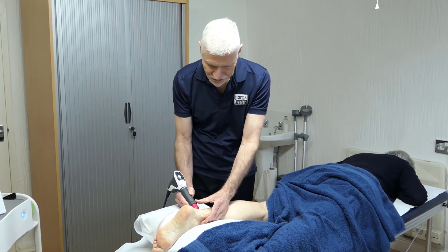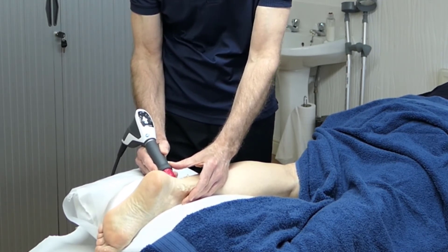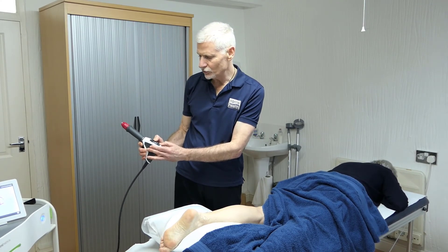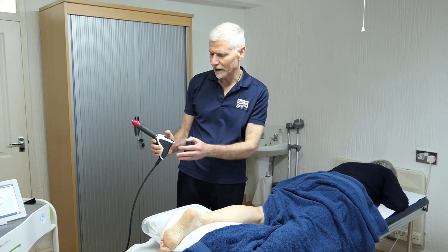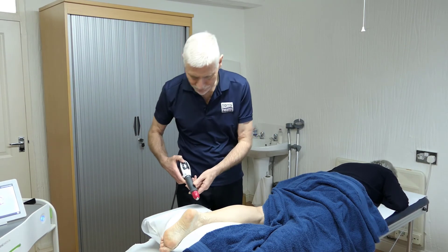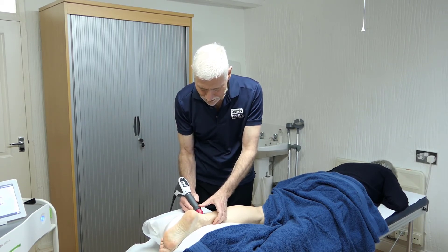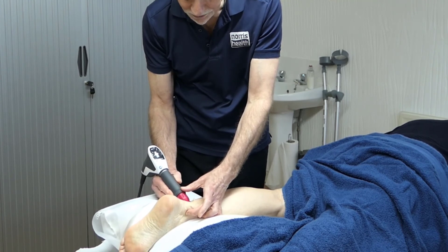At the moment I'm treating the side of the Achilles — the lateral aspects — and I can also treat the back and the medial aspects. Once I've done that, I can then increase the pressure and reduce the frequency, giving a different amount of force going in. My pressure now is one and a half bar and my frequency is eight hertz, producing a different sound on the machine. If I put my finger on the other side of the Achilles, I can actually feel that pulse going through.